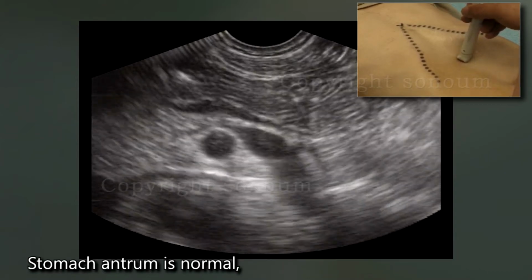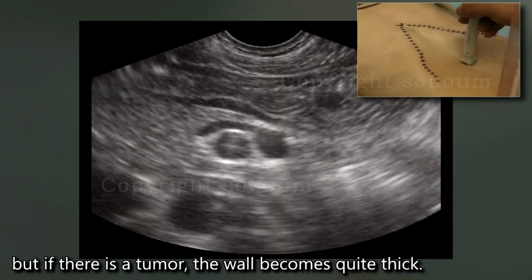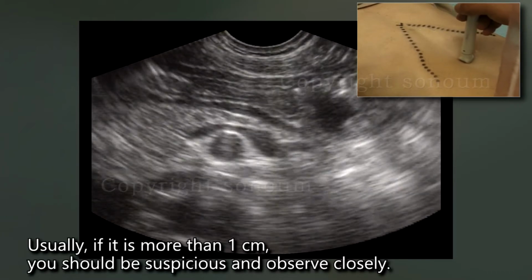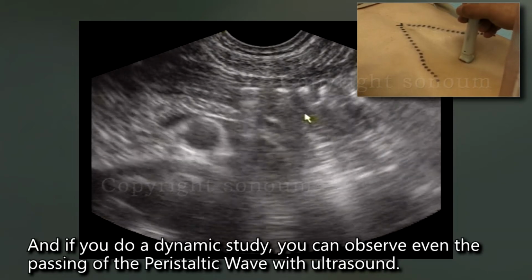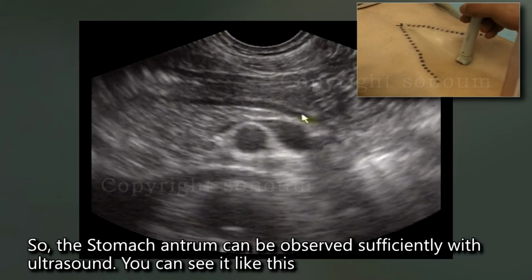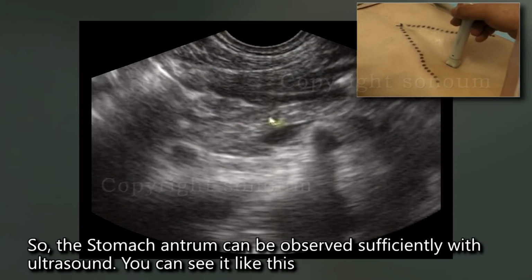The stomach antrum is normal. But if there is a tumor, the wall becomes quite thick. Usually, if it is more than 1 centimeter, you should be suspicious and observe closely. And if you do a dynamic study, you can observe even the passing of the peristaltic wave with ultrasound. So, the stomach antrum can be observed sufficiently with ultrasound. You can see it like this.